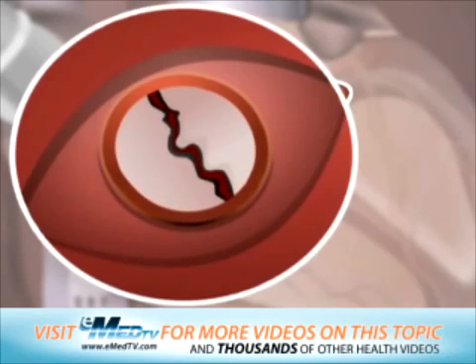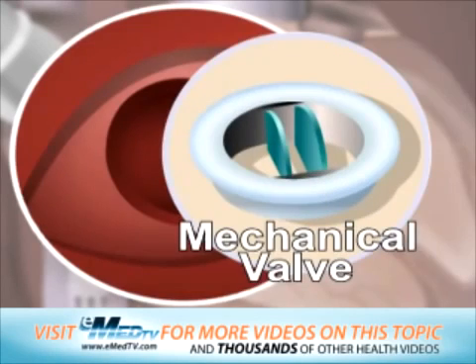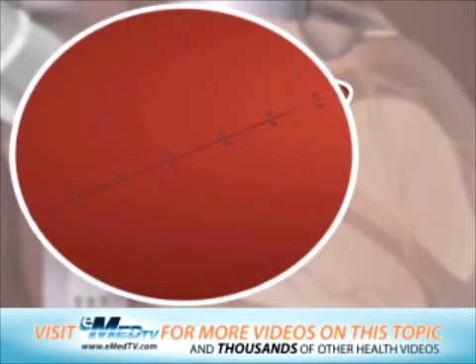The surgeon will then carefully remove the old mitral valve. At this time, the doctor will select a mechanical or tissue replacement valve and will sew this into place with stitches. Once securely in place, the atrium will be closed with stitches.